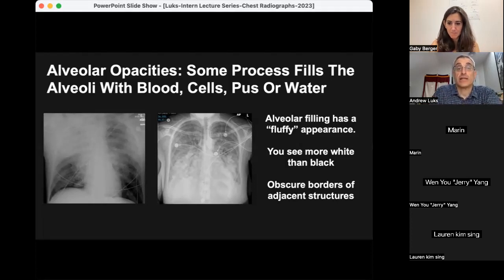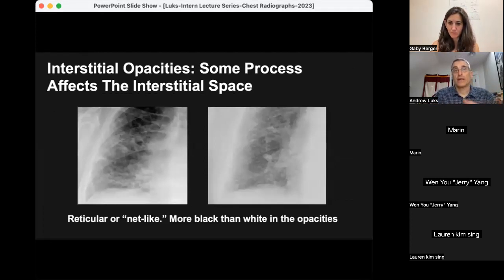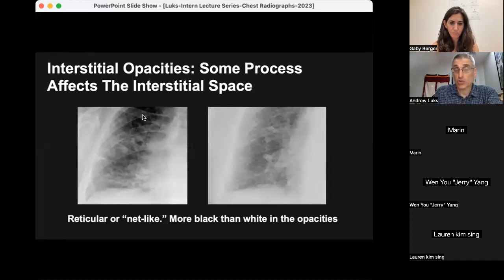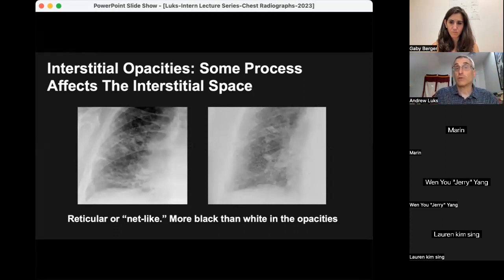Interstitial opacities refer to a process affecting the interstitial spaces — the inter-alveolar septa — leaving the alveolar space alone. These opacities are often described as reticular or net-like: lots of white scraggly lines throughout the lungs. In distinction to alveolar opacities which are very fluffy and white with little black, interstitial opacities still have a lot of black within them, because the alveoli are still often open and filled with air.